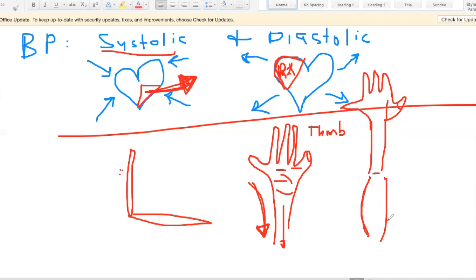A lot of times people will put the stethoscope right in the crux of their elbow, right in the joint of the elbow, right in the middle. But the problem with that is that there are a number of different blood vessels that go through here. So if you put the stethoscope directly in the middle of your elbow joint, it actually doesn't give such a very clear beat or sound. What I usually do is, maybe you can just look at the screen. Maybe this is easiest.